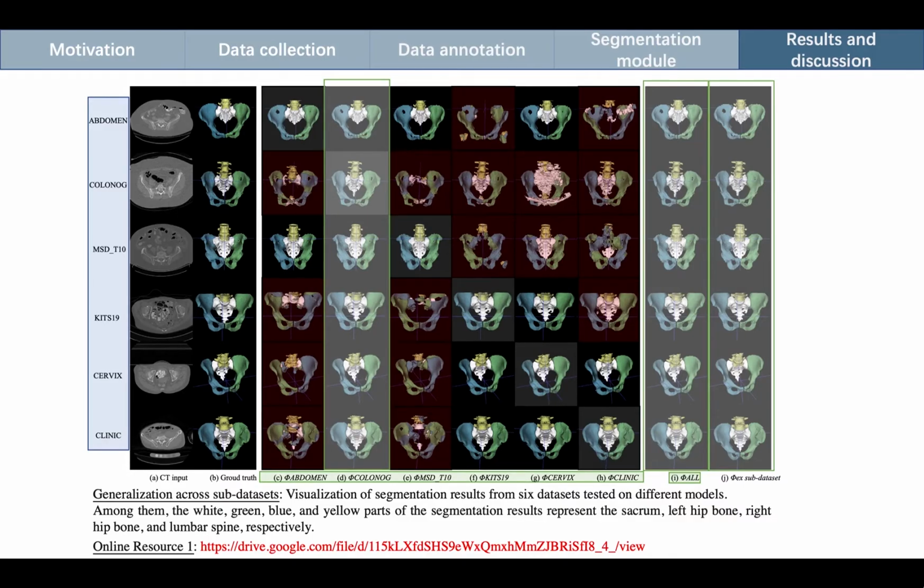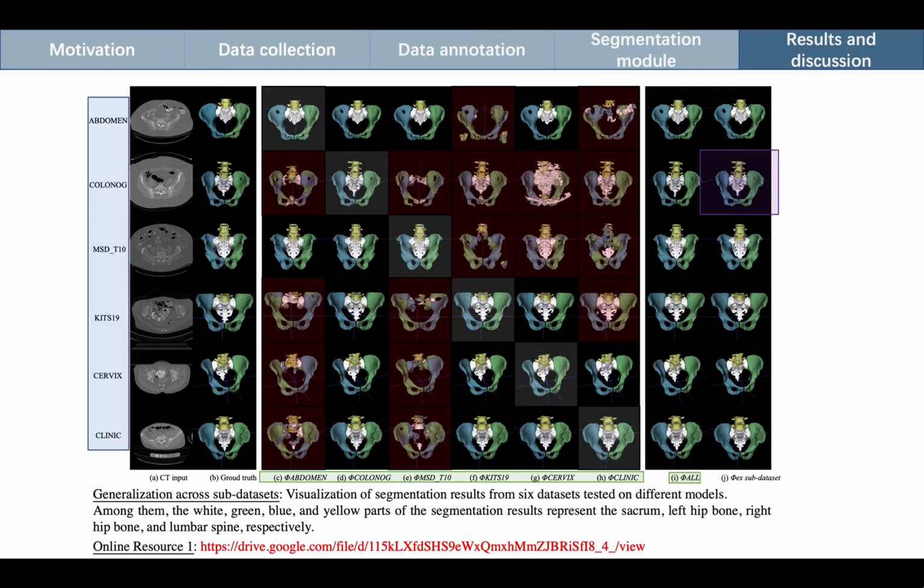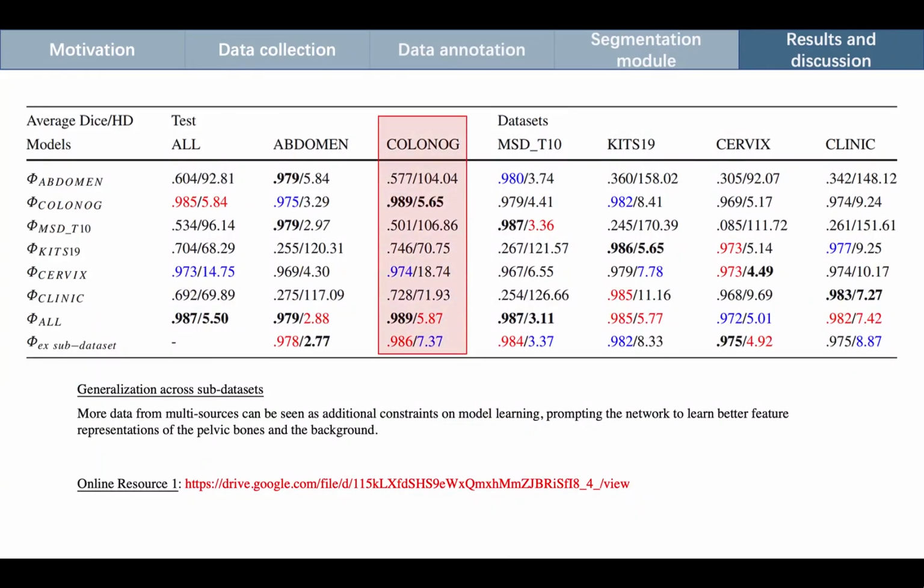The result of EX-(OG) can fully explain that training with data from multi-sources can achieve good results on data that has not been seen before. The models trained separately on the other 5 sub-datasets cannot achieve good results on (OG). But aggregating these 5 sub-datasets can get a comparable result compared with model all, using only 1/3 of the amount of data.